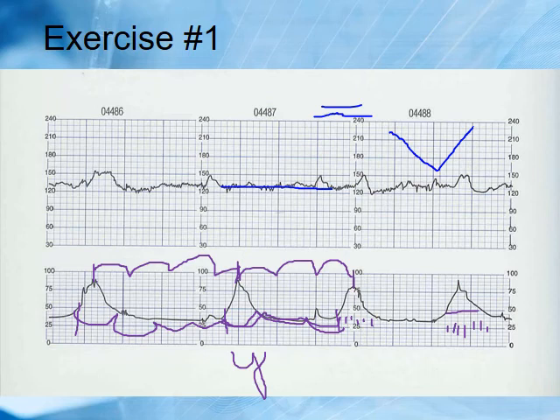Are there any baseline changes, i.e. accelerations or any decelerations? And remember the 15 by 15 rule for an acceleration. This looks like one, is it? Is it the 15 by 15? It goes from that baseline of 130 up to 150, so yeah, that's 20. And then it lasts 10, 20, 30 seconds. So yeah, that's a good acceleration.